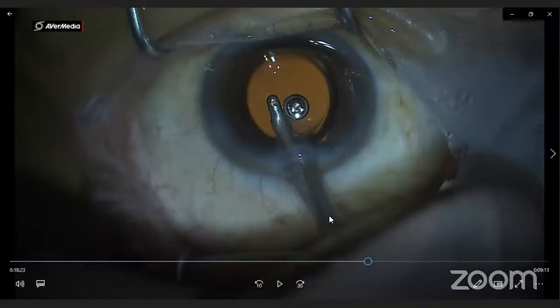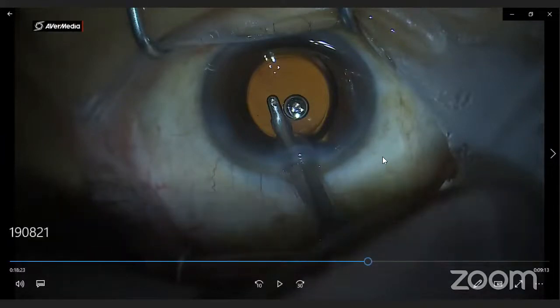So actually nothing to share about this. It's just about the divide and conquer technique that I was used to last time, but I plan to change to the chop technique. I hope I can. So itulah.